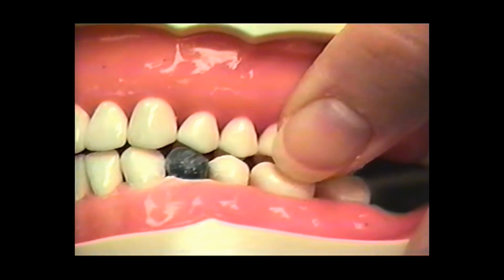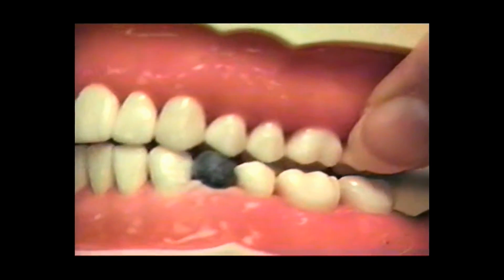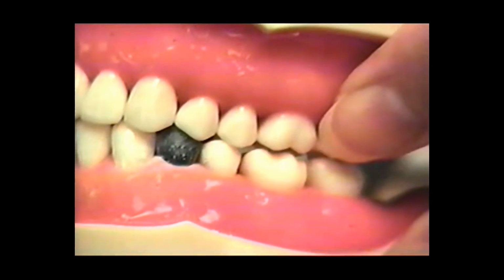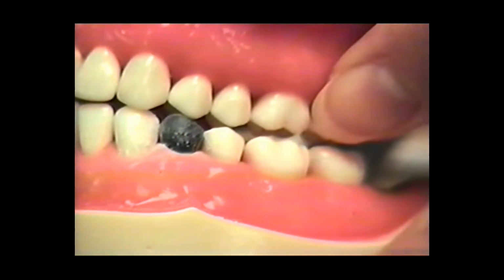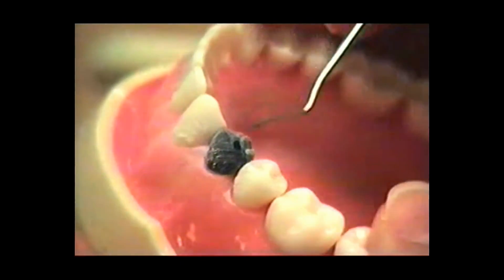And we don't want to be touching. These other teeth are pretty close, but they're just barely not touching. Let's try this angle again. Keep taking it out of focus. We're close on this one. And I'll show you right where it is. We're getting a mark right here. So we would take that down.